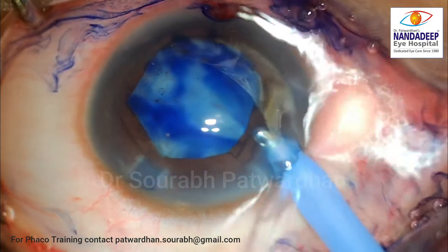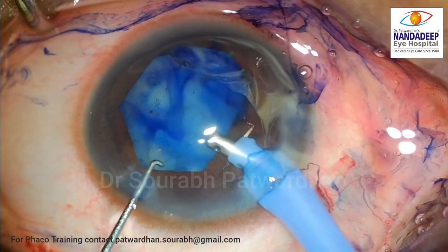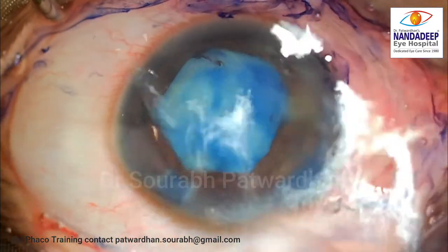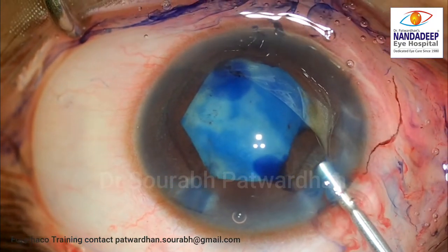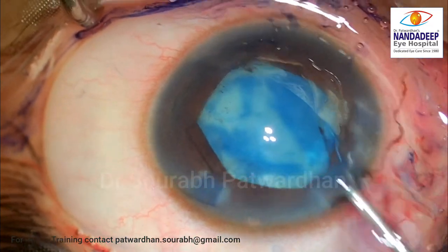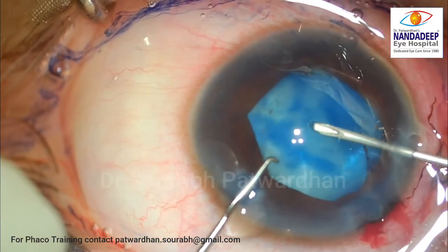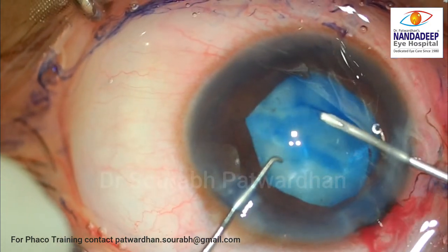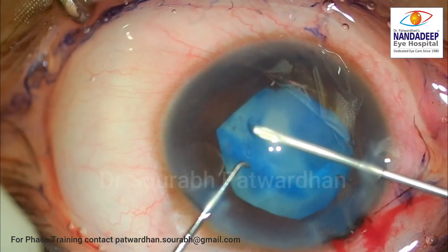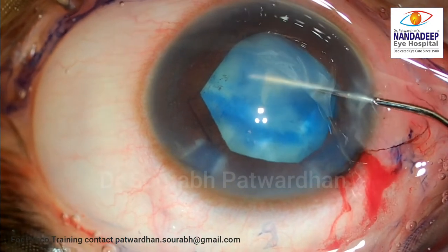You can see that I tried to wash the OVD but the IA probe was going underneath the B-hex because of no space. So I carefully manipulated over the B-hex ring and removed the OVD so as to remove the dye which might be affecting my visualization during capsulorrhexis. I re-injected chondroitin-hyaluronate combination to make some space for working. As I tried to puncture the anterior capsule, you can see the lens is moving, indicating that zonules are probably more elastic or there might be some weakness of the zonules, though the capsule appeared quite tough.